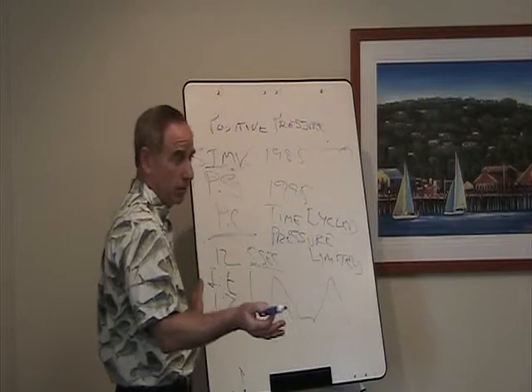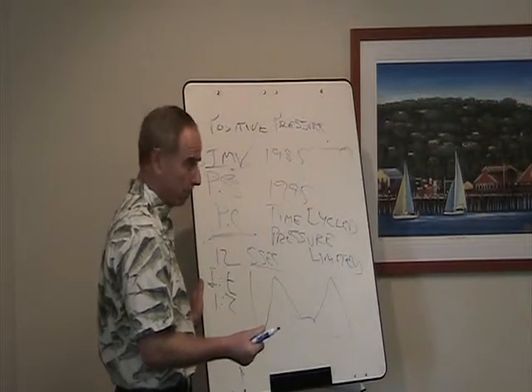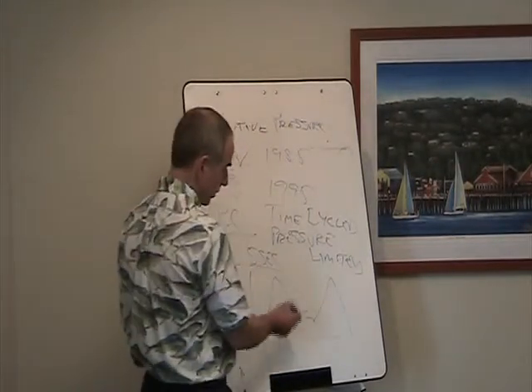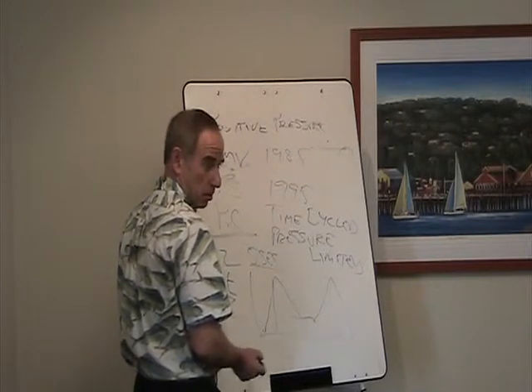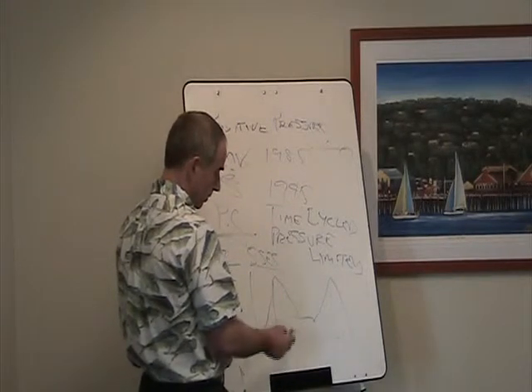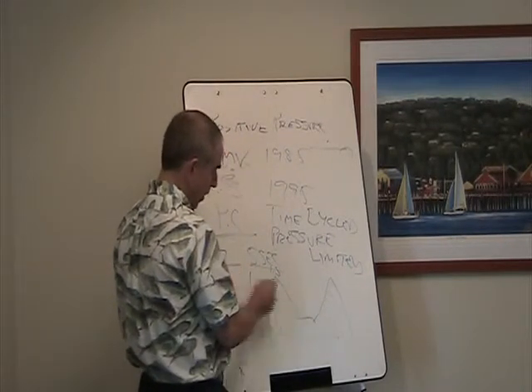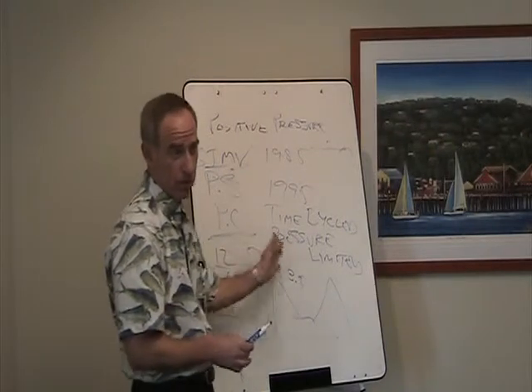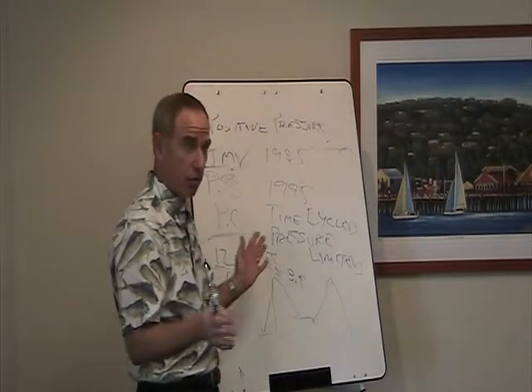Okay. Remember, expiration is passive. So you breathe in, and then it takes longer to get the air out. Okay, because it's passive. You're not forcing it out, right? So that's the normal IE ratio. So if this period is every 5 seconds, the inspiratory time will be a lot shorter than the expiratory time. So say I set this at 1.5 second inspiratory time, that's going to allow him breathing every 5 seconds, then you're going to have around a 3.5 second expiratory time. It's not quite 2 to 1, or 1 to 2, right? You have to adjust it a little, 1.7 to whatever, 3.3, something like that. Okay, that would be a normal IE ratio.